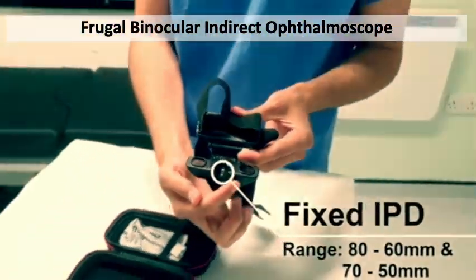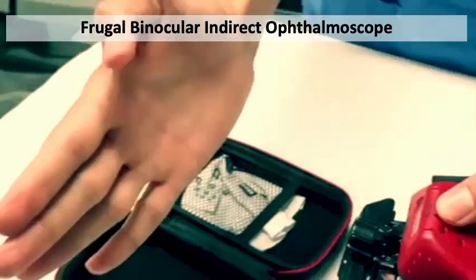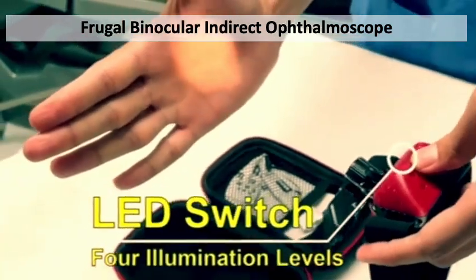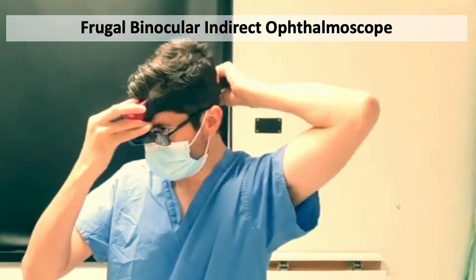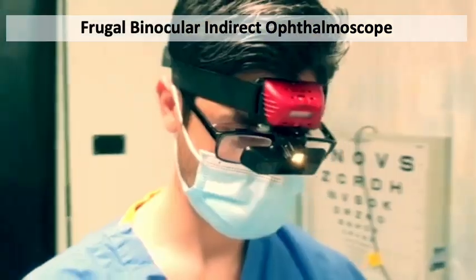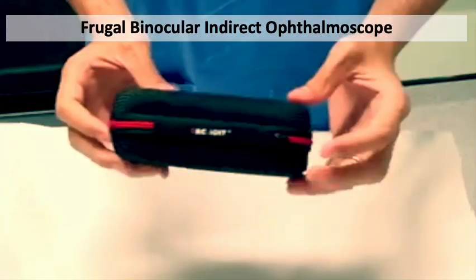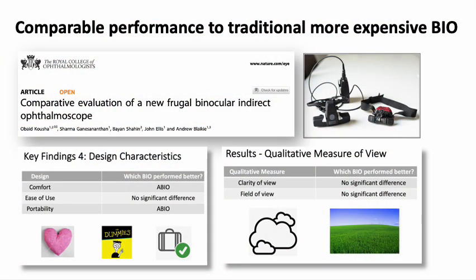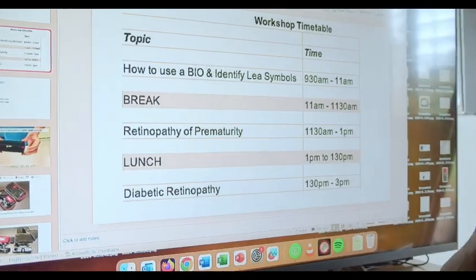The IPD is fixed, but with a wide optical entrance it can accommodate a wide range of IPDs. There's only one control button, which alters the brightness of the light, and overall I found it very comfortable and simple to use, giving an excellent view of the back of the eye. So far there's been one comparative study published in Eye, and this found comparable performance to a much more expensive orthodox spectacle-mounted device. To effectively implement the indirect, we have established interactive workshops.